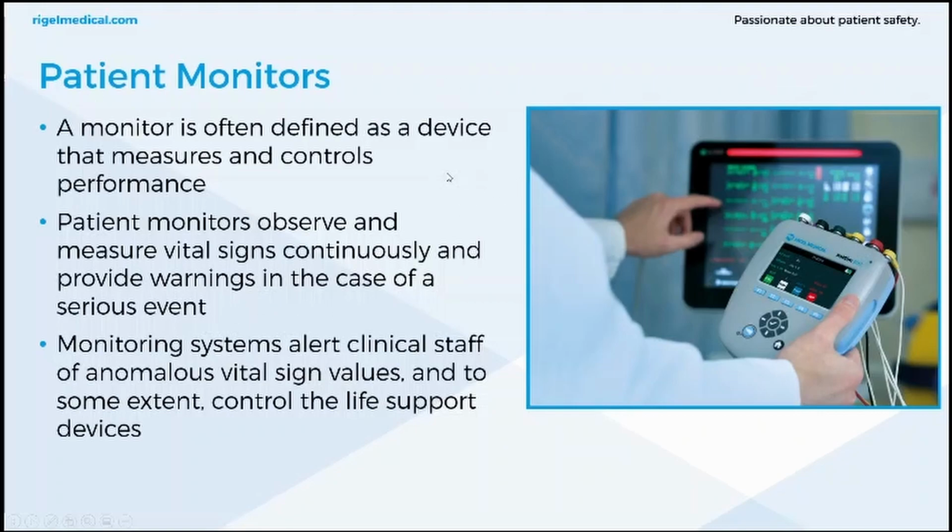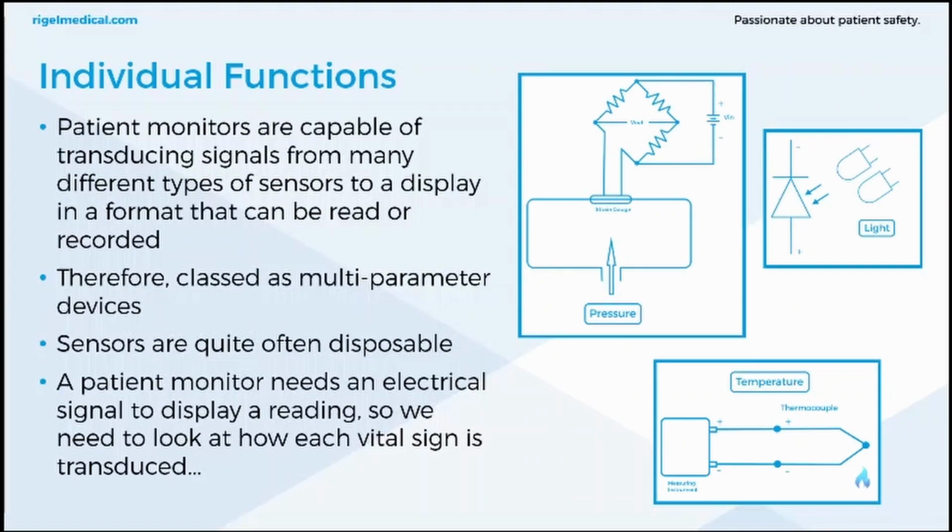And something that sometimes is not as clear, which is why we highlight it, is that a monitor is defined as a device that measures and controls performance. Sometimes it can be misconstrued that monitors actually just measure. They're used to measure conditions, but they are there to control performance as well. So that's becoming more and more commonplace for modern patient monitors, really comprehensive devices.